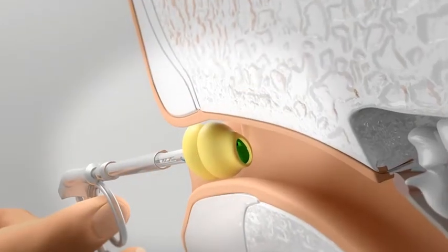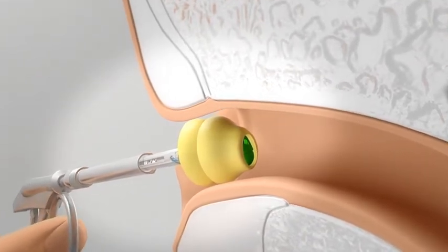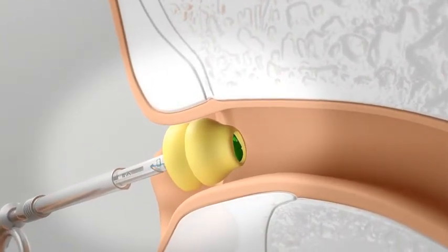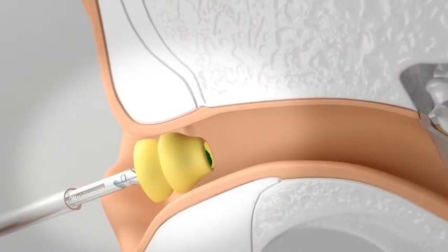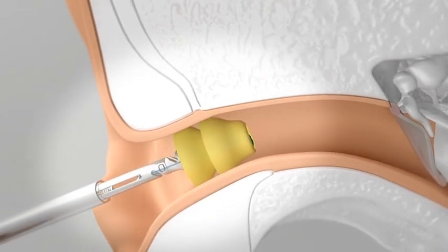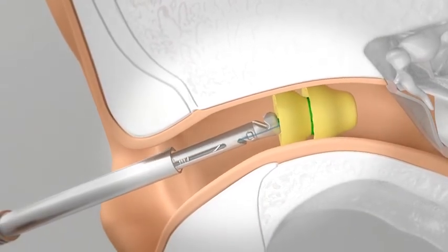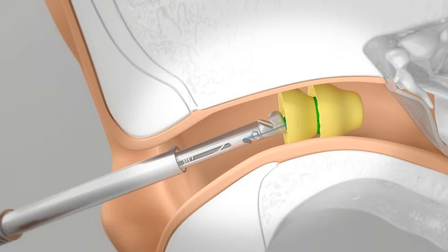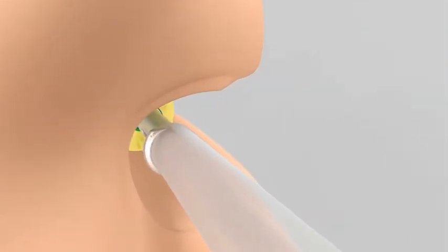Be mindful of the need for variable tension while steering through the canal. Each ear is different. However, for most ears, more tension will be required to maintain the appropriate device angle when navigating the bends of the canal. Once past the posterior meatus, tension should be relieved to ensure that undue pressure is not applied to the canal walls. The maximum insertion depth should be treated as a not-to-exceed value and is reached when the sliding depth ring lines up with the posterior meatus.